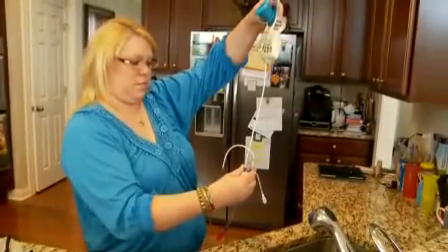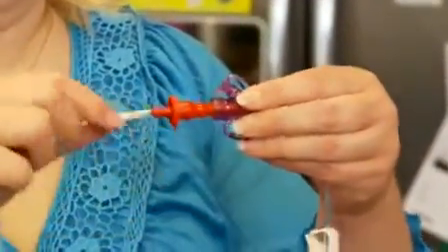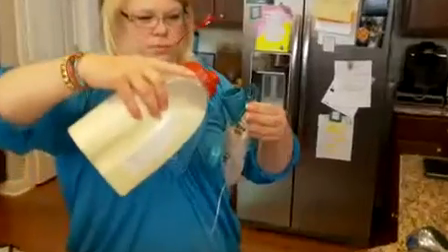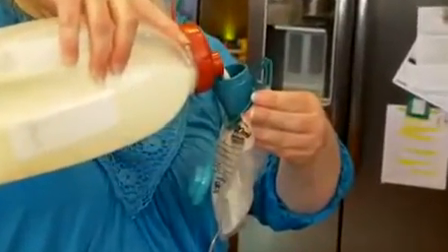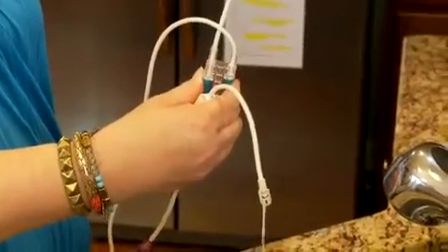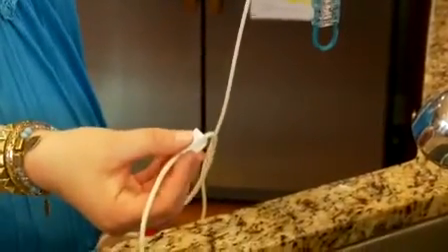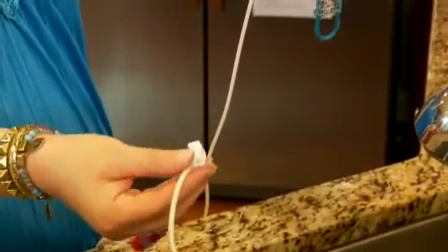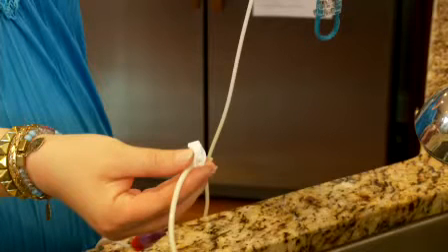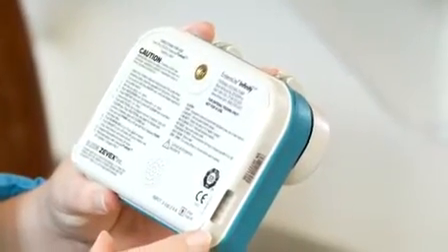Always prime the tubing first. Attach the feeding bag tube to a right angle feed set and clamp one or both tubes. Pour the prescribed amount of formula into the feeding bag. Unclamp the tubing to allow the formula to flow through, pushing the air out to prevent it from being pumped into the stomach. Once the formula reaches the feed set, reclamp it to prevent the formula from spilling. Then attach the feed set to the MiniONE Balloon Button and begin feeding. Follow the instructions from your pump manufacturer to operate your continuous pump.